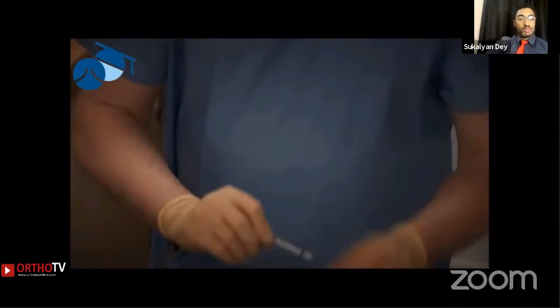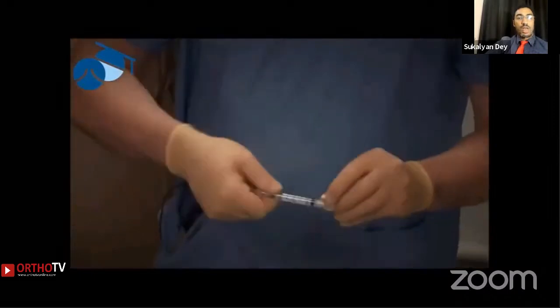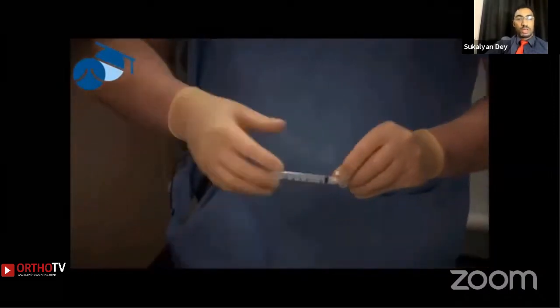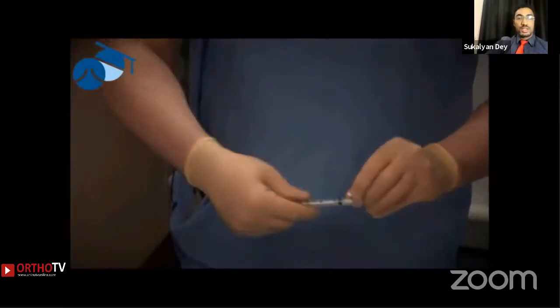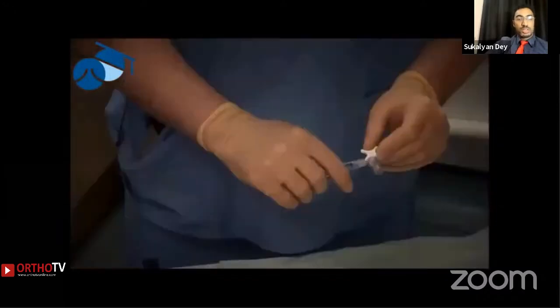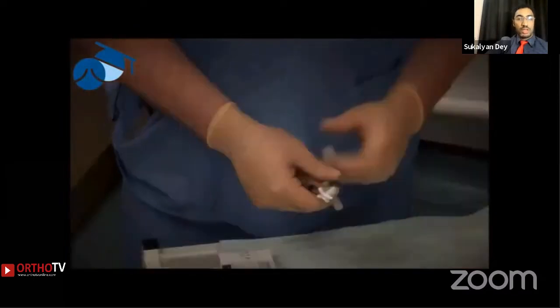We take 1 cc of polydecanol in the lower lock syringe, and we attach it to the perpendicular arm of the 3-way cannula. On the second arm, we take a 5 cc syringe and fill it up with 4 cc of oxygen mixed with carbon dioxide, and we lock it.